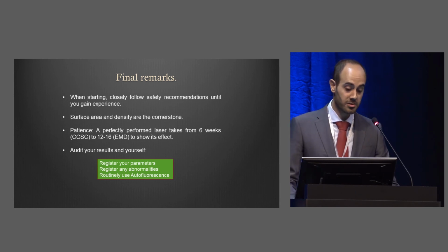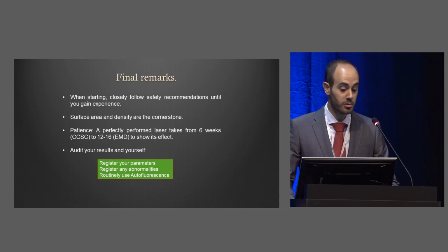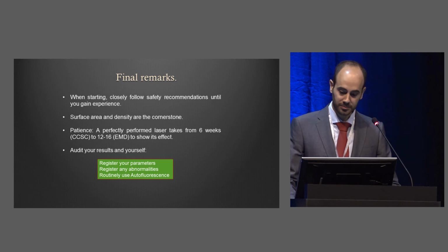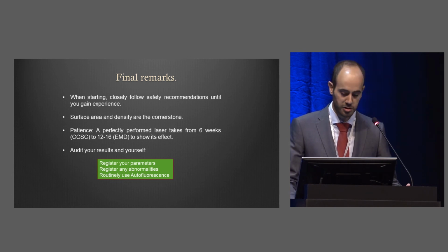In final remarks, of course, as always, when you're starting, follow safety recommendations until you gain experience and confidence. Surface area and density are the cornerstone. This is the idea. Patience. Laser is at least relatively slow compared to what we're used to with intravitreal. And of course, it's more surgical than medical retina. This is an interventionist procedure, so audit your results and audit yourself.